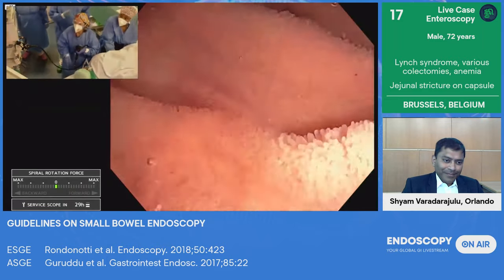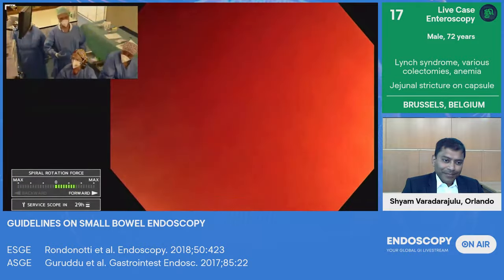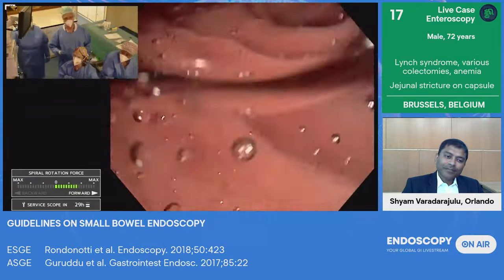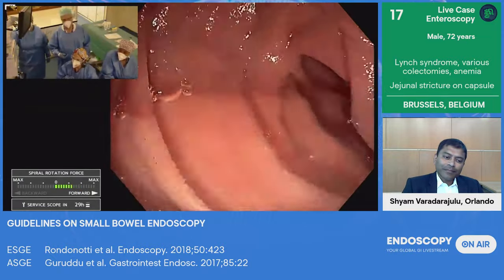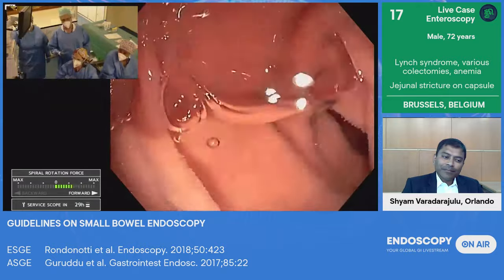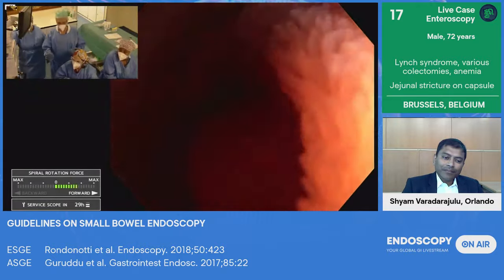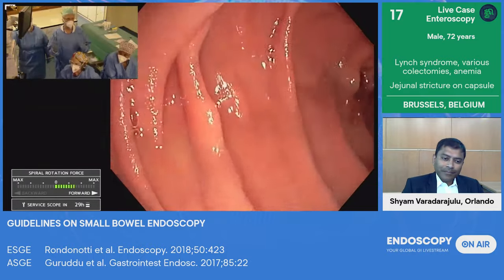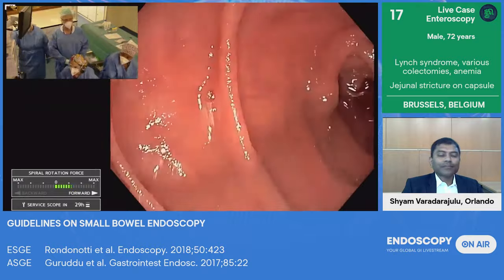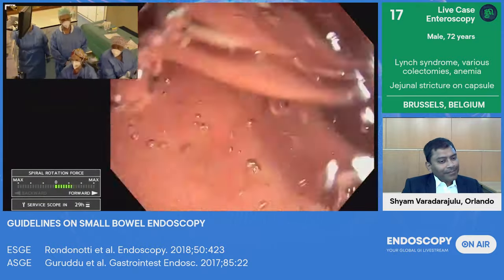The thing that we have to acquire there is that very often we may advance with the endoscope almost in a straight position and then just apply a modest pressure, because from the time you have passed the Treitz angle, what we want is just to let the small bowel pleat over the spiral. And this is easier when you are in a more straight position.